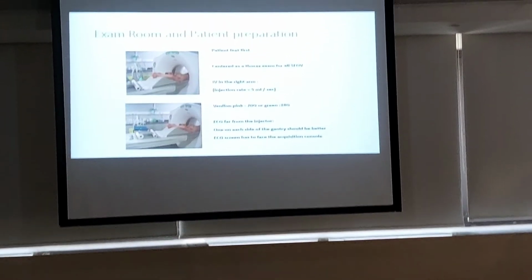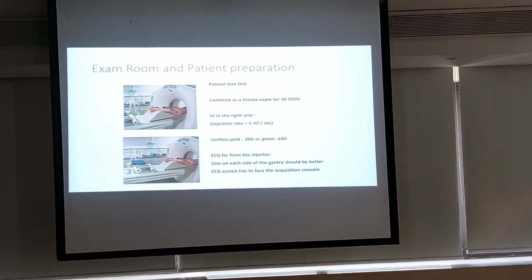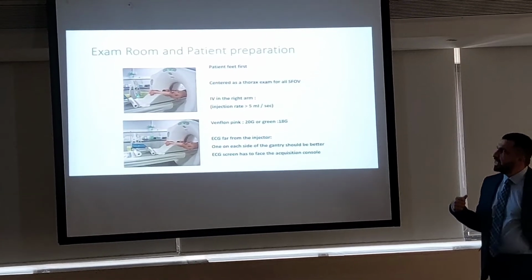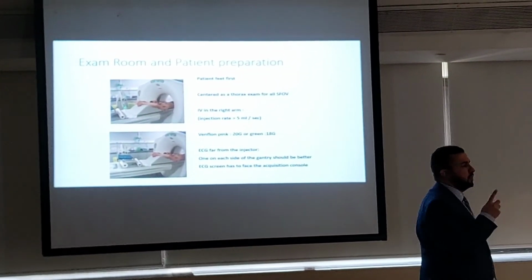In the exam room, this is the patient position and patient orientation, and the centering. Always make sure you are centering the patient in the proper isocenter. This is more effective for the quality in the cardiac CT scan.